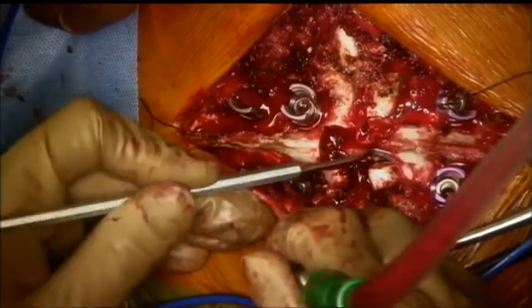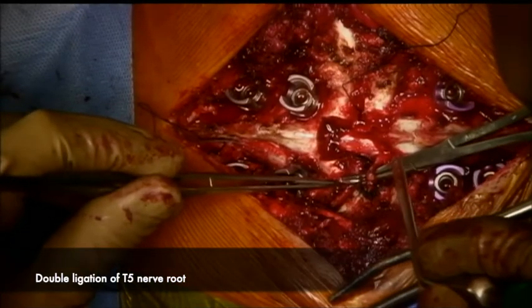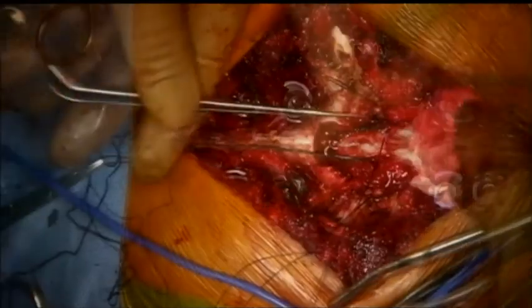Once that is removed completely, the pedicle of T5 is palpated and removed piecemeal. The T5 nerve root is then doubly ligated and divided. Similar steps are carried out on the left side.